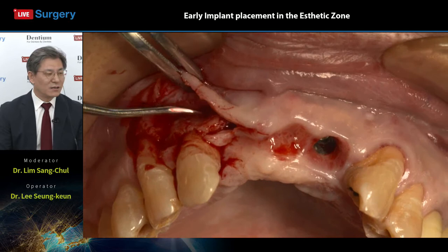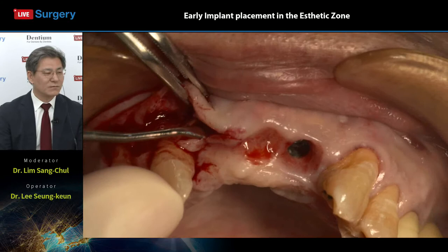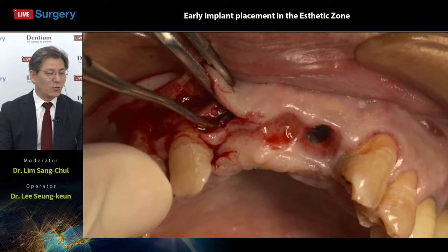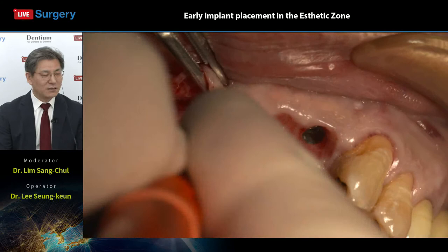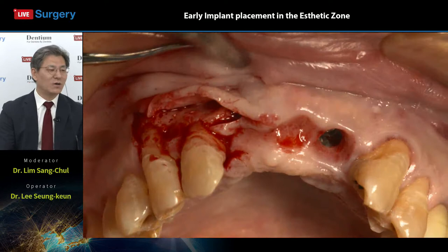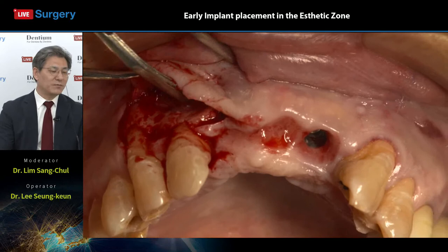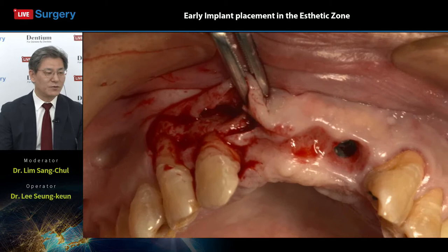He holds the soft tissues with the bone tweezers, and for implant placement I need a full thickness flap. He mentioned the full thickness flap. When you have implant installation, the full thickness flap is a necessary and basic part. After full thickness flap reflection, we can do another procedure like GBR and drilling or harvesting autogenous bone, and all these procedures can be done, right? So the full thickness flap reflection is the first step for proper implant surgery.